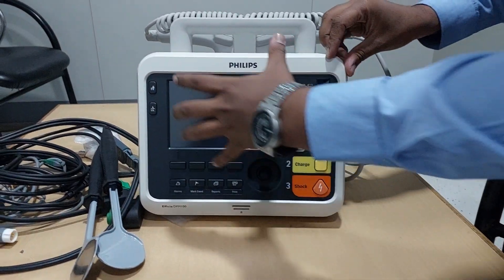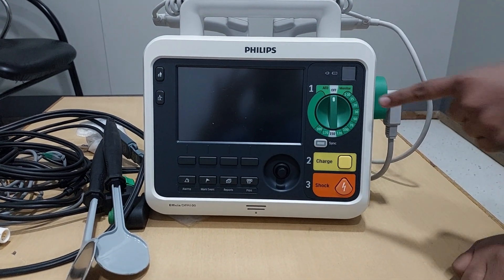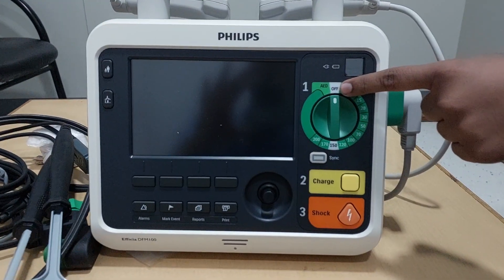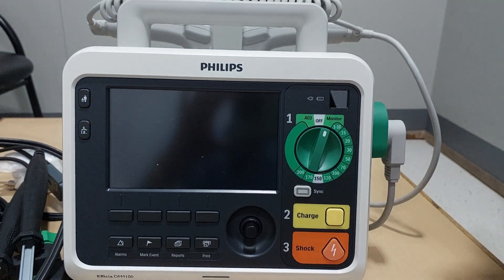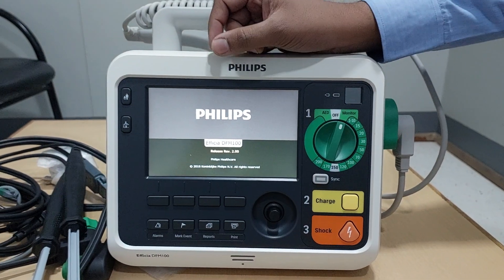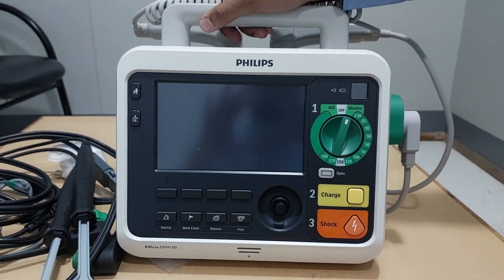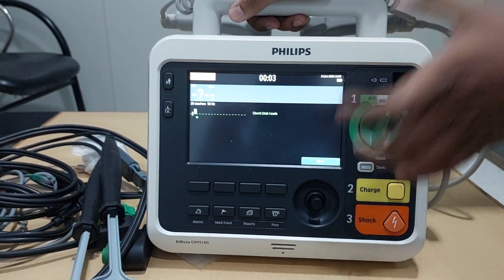You can see this is the basic screen of this defibrillator. How to switch on this machine — you can observe this arrow on the right. It is in the off mode, that means it is off. To turn it on, you have to rotate it. The machine takes some time to switch on and is now booting.